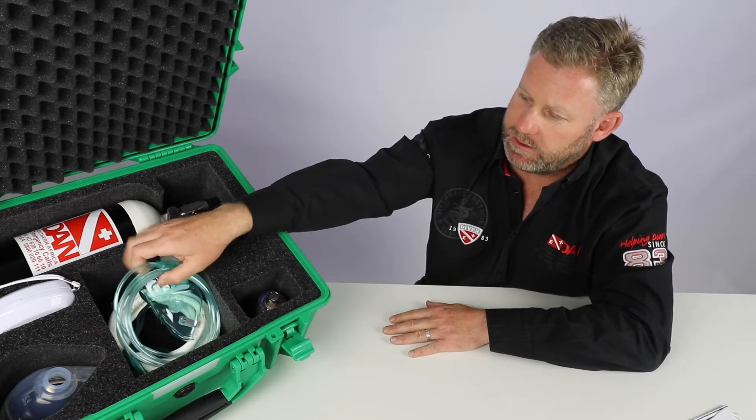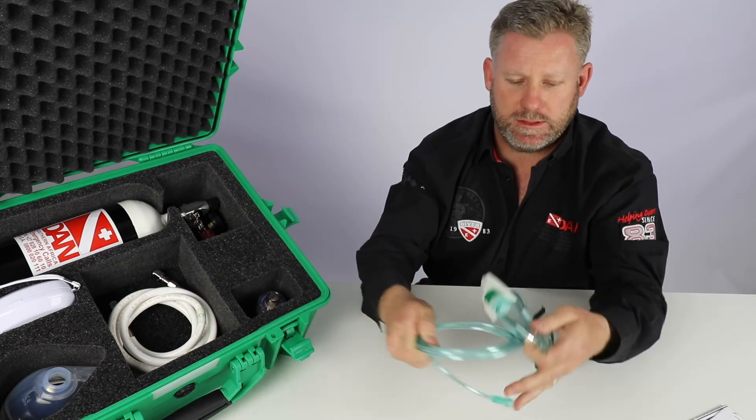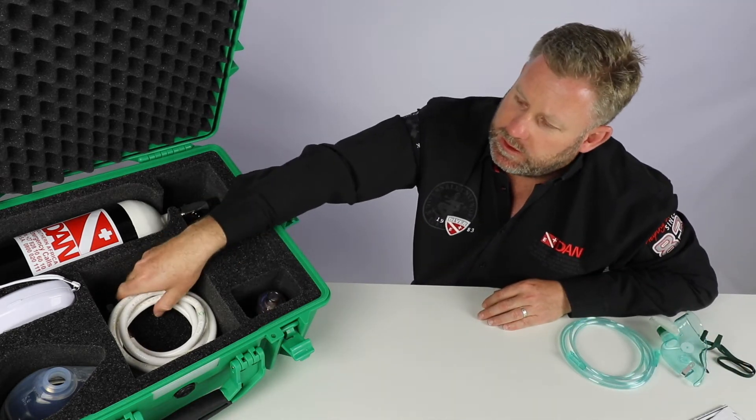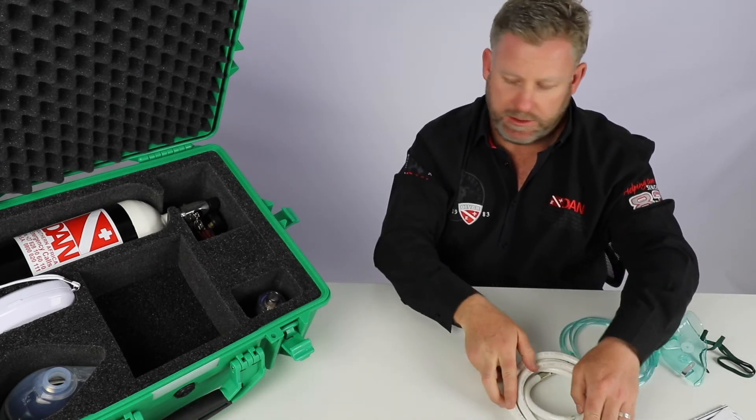On the inside here, the first thing we pull out is the non-rebreather mask with the hose that comes with that. You can see over here is the standard hose which you will connect to your pin index and connect everything to.